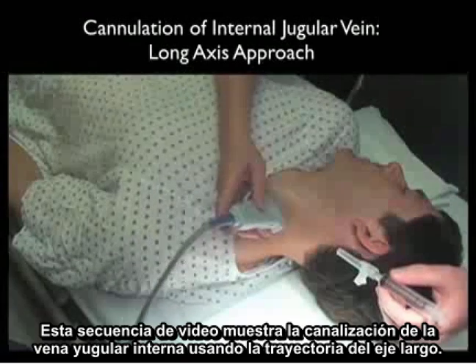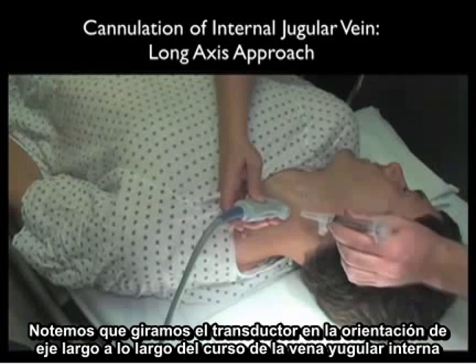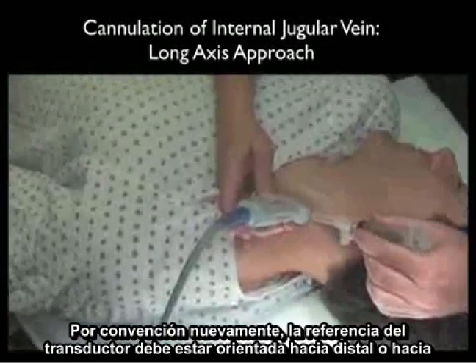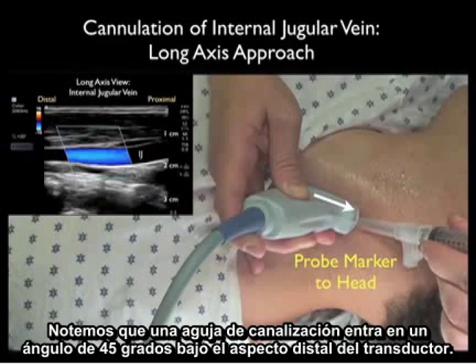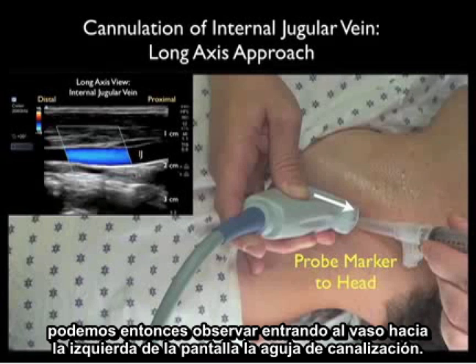This video sequence shows cannulation of the internal jugular vein using the long axis trajectory. Notice we swivel the probe into the long axis orientation along the course of the internal jugular vein as it runs up and down the patient's neck. By convention, the probe marker should be oriented distally — towards us as we stand at the head of the bed. The cannulating needle will come in at a 45 degree angle under the distal aspect of the probe, and since the distal marker orients towards the left of the ultrasound screen, we look towards the left of the screen for the cannulating needle.